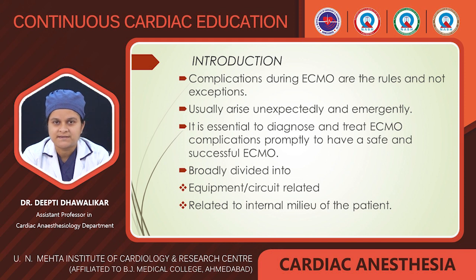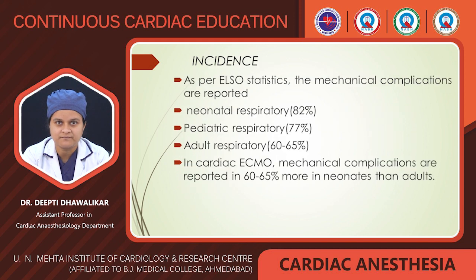So these complications are broadly divided into equipment or circuit related or mechanical complications, which we will be seeing today, and the rest are related to the internal milieu of the patient, which are patient related complications that we'll be looking at in subsequent lectures.